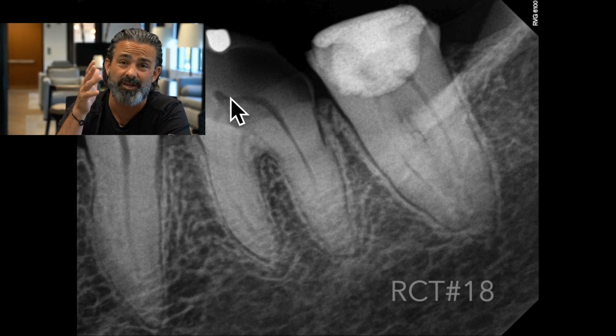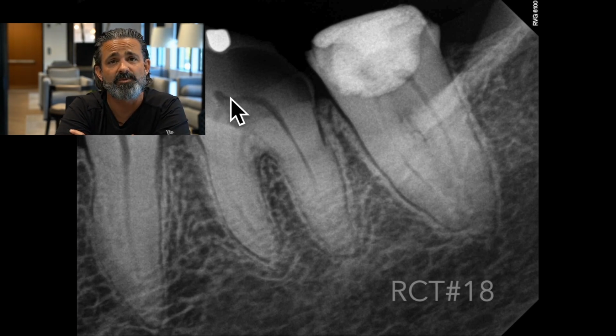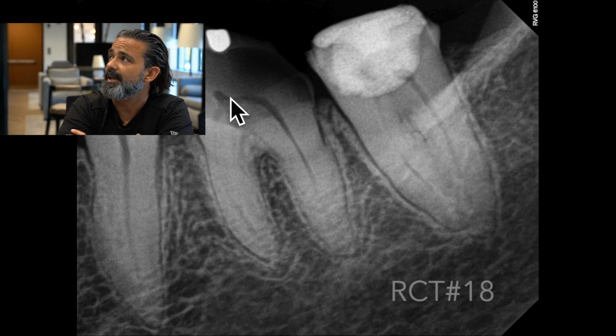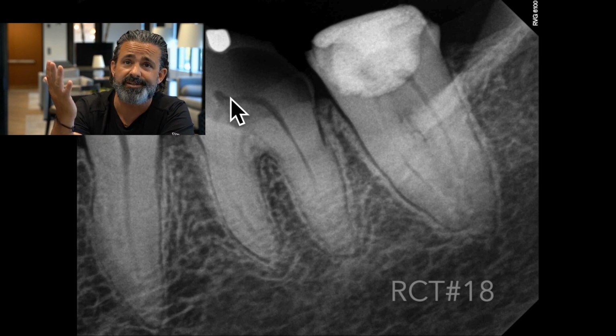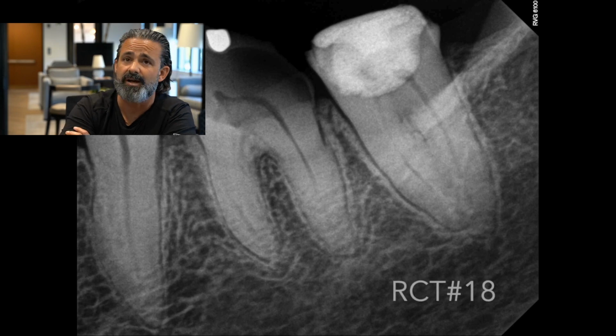It was requested of the dentist that 19 was going to be slated for extraction in their treatment plan, and 18 was to be saved. I'm going to show you what that looks like. The x-ray actually does it some justice, but the clinical photos, it's compromised. But that is the treatment plan that was requested of us. And I know you all, as endodontists, get dealt cases like this on a daily basis, and we love them and we hate them. We love winning them, but we hate doing them. So let's take a closer look at what this is about.